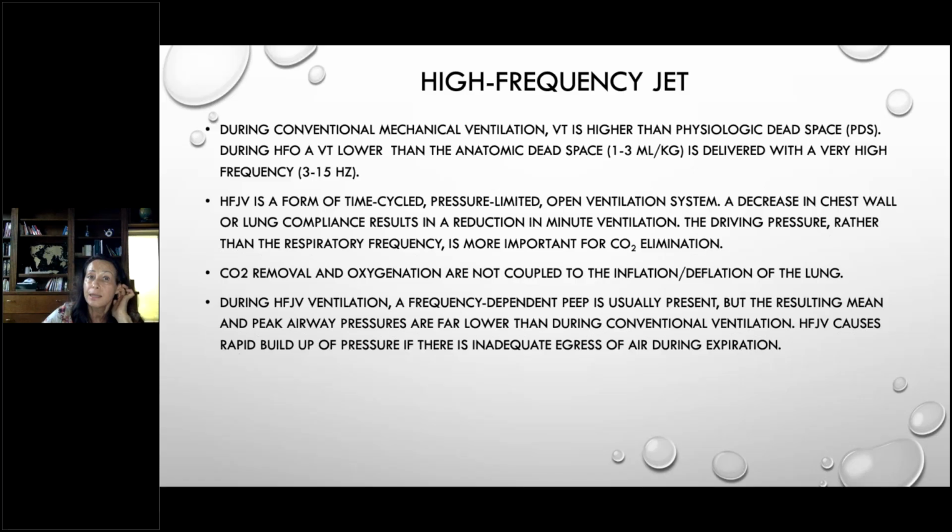So it is a time-cycled, pressure-limited, and most importantly, open ventilation system. If the chest wall compliance decreases, then we deliver less oxygen into the peripheral airways. So the oxygenation is going to be worse, and it will markedly decrease the minute ventilation.